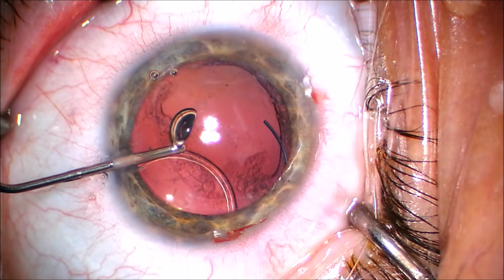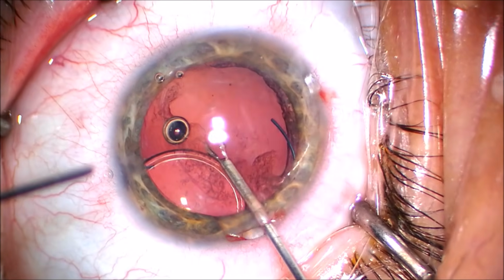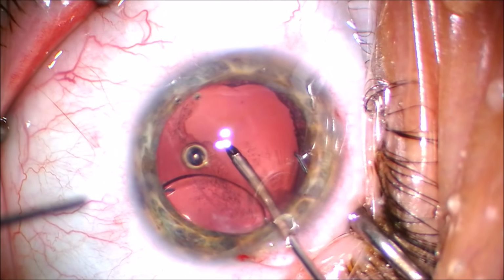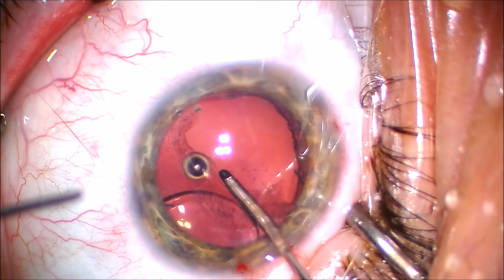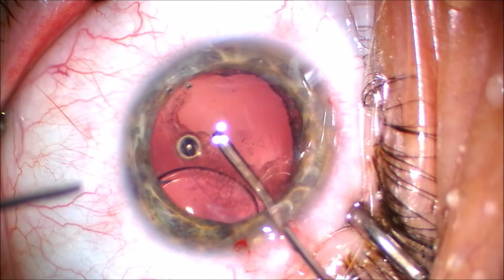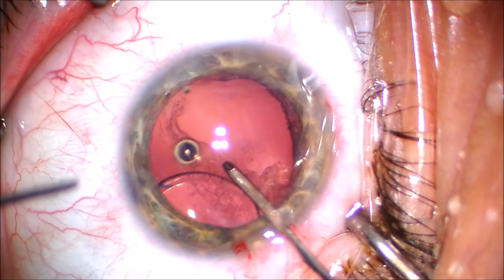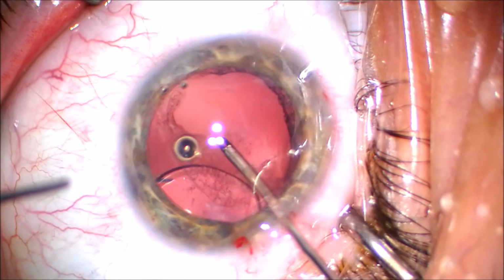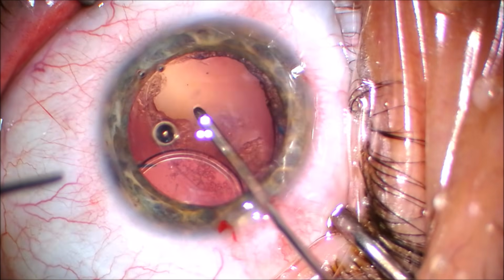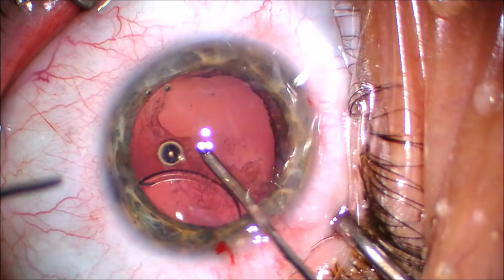So I've decided to make a posterior capsulorhexis. These are the sharp tip Moria microrhexis forceps. I punctured through the center fairly easily, but as you see, because I just make a hole, I'm trying to create a rhexis, and there's no way to create a flap because there's no sharp edge. I just have a puncture here, almost like a mini rhexis. And so I'm not going to be able to make a capsulorhexis very easily here. And so I'm just trying to grab and see what I'm going to do. I'm grabbing, and all it's doing is just creating tension on the posterior capsule.